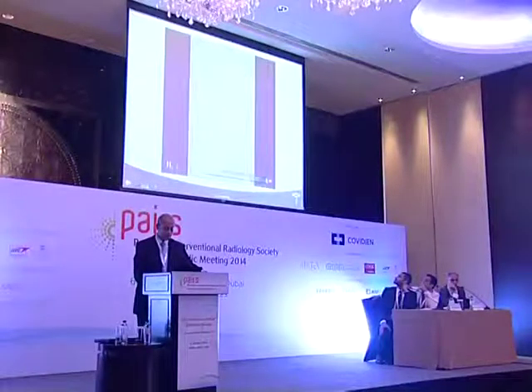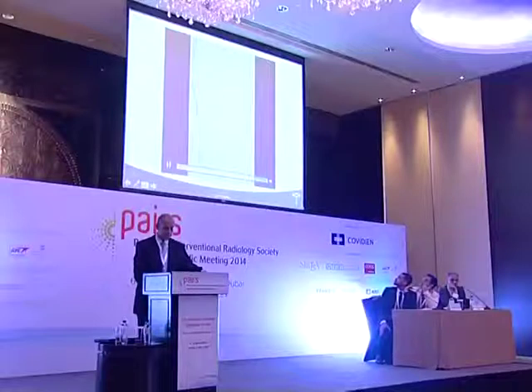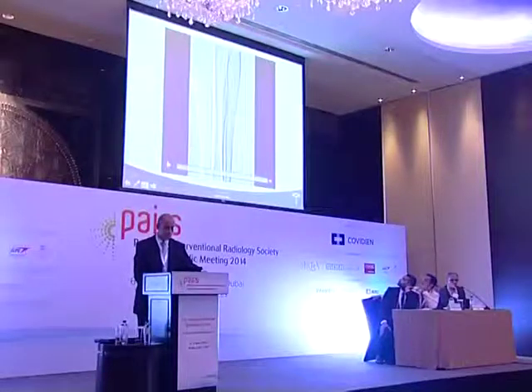Here you see that the peroneal is diffusely diseased, and the AT as well. Your point is well taken as to the picture probably should have been taken from the popliteal segment in order to do a selective angiogram. But when you get these referral cases, you don't get all this stuff that you want. It's like Christmas. You get what you get, and you got to deal with it. And here is the TP trunk as well. And that's what we got.